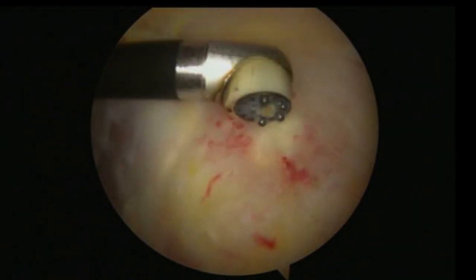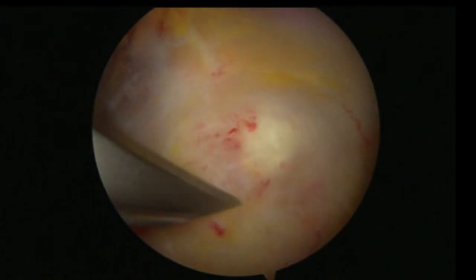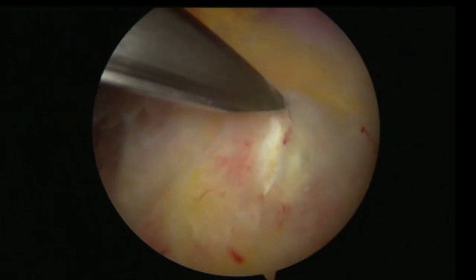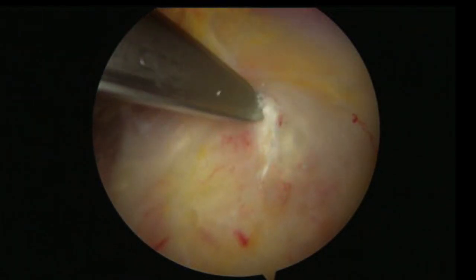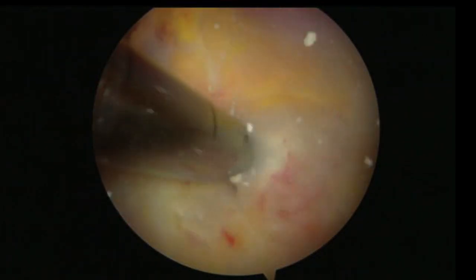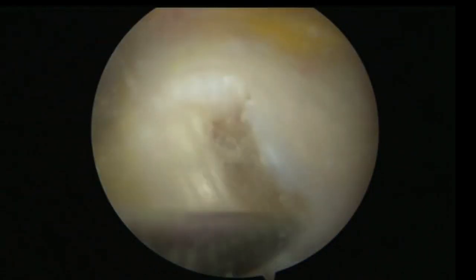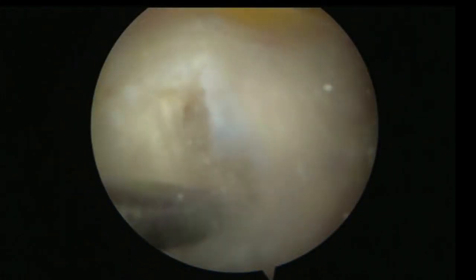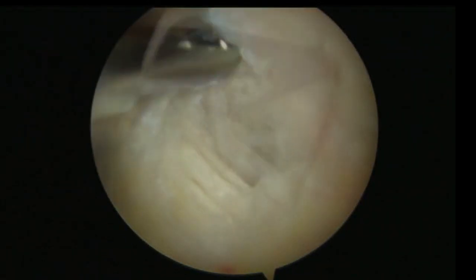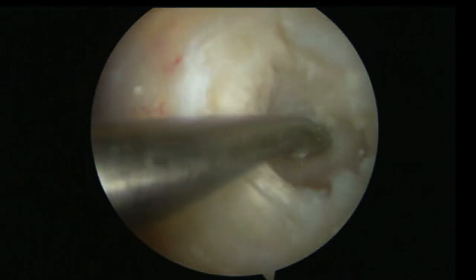With the scope in the anterolateral portal of the right shoulder, a radiofrequency probe is inserted via the posterior portal to remove the subacromial bursa and identify the region of calcification. An 11-blade knife is inserted through the rotator cuff tendon in a longitudinal fashion to allow for excision of the chalky white calcium deposits. An arthroscopic shaver is then inserted into the supraspinatus tendon, and the calcium deposits are removed from within the tendon. A curette and shaver are used to ensure that all calcific deposits are removed from within the tendon, and the shaver is used to remove the remaining deposits in the subacromial space. It is important to copiously lavage the joint of all calcium deposits, as leaving calcium in the joint increases the risk of postoperative stiffness and adhesive capsulitis.